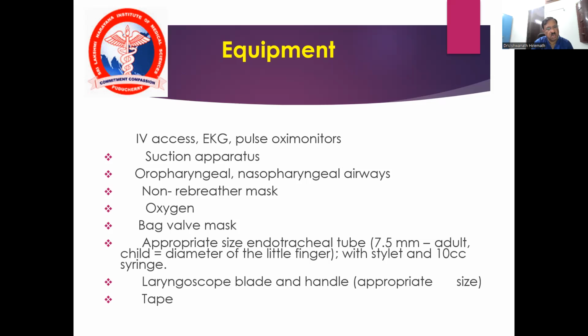For that reason, the IV cannula, IV fluid, IV set, then monitoring of the heart by the ECG, so multi-para monitor, pulse oximeters, which are essential for monitoring the hemodynamic condition of the patient.